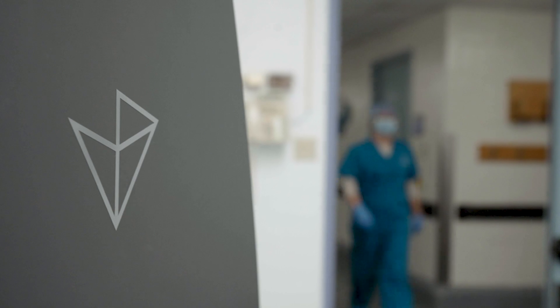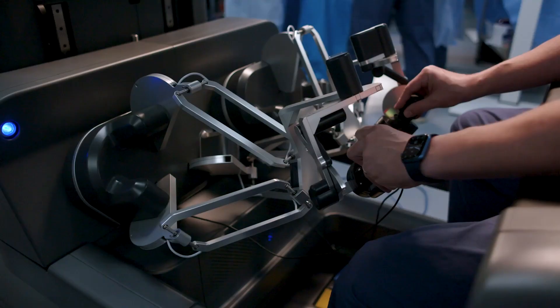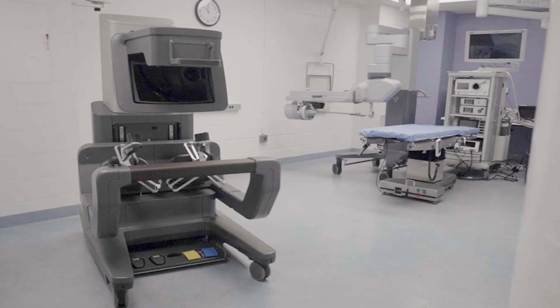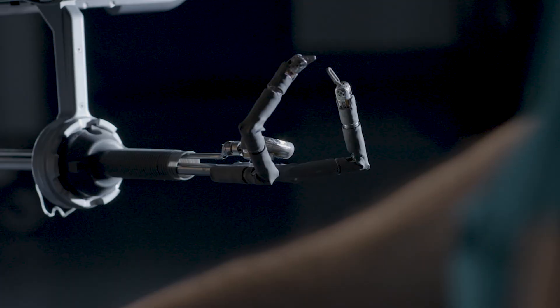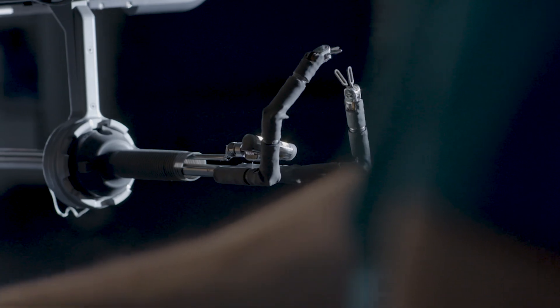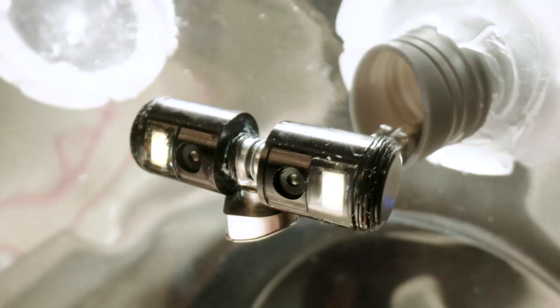At Vicarious Surgical, we are inspired by the opportunity to improve patient lives. We are developing next-generation, life-changing medical technology through the blending of robotics, computer science, and advanced visualization.